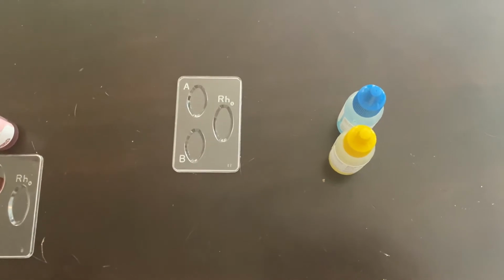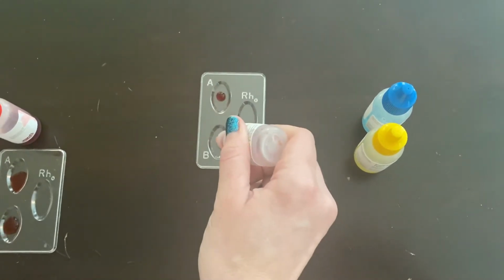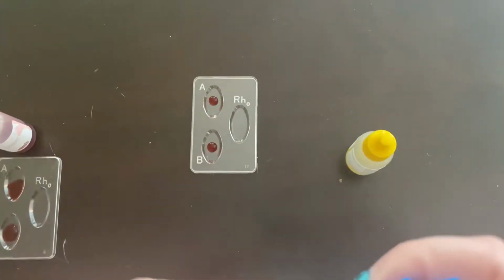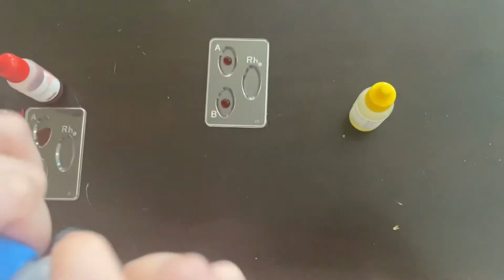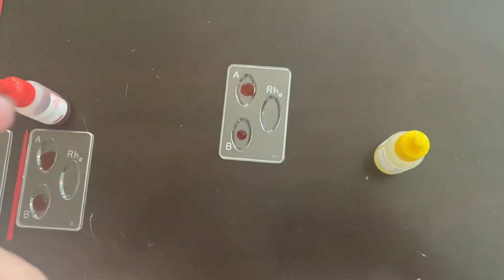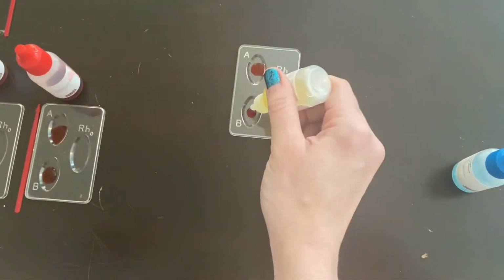So what we would do in a lab if we were testing blood is you would take the blood sample and put a couple of drops in the A and a couple of drops in the B. And then you take a serum that's called anti-A serum. What that means is if you put this in and the A antigen, so the A allele, is present, it will cause what we call agglutination. And that means that it's going to attack and show that that is present.